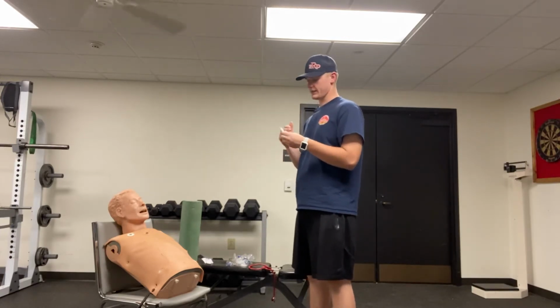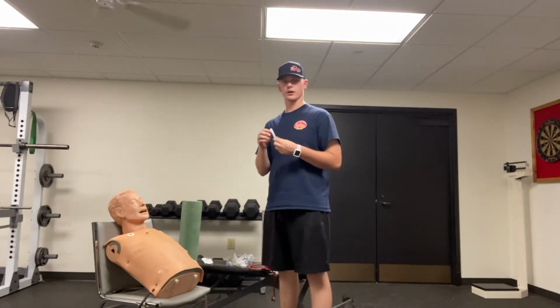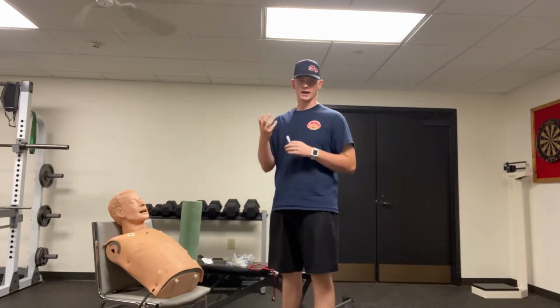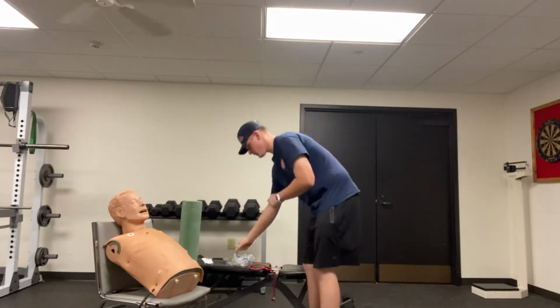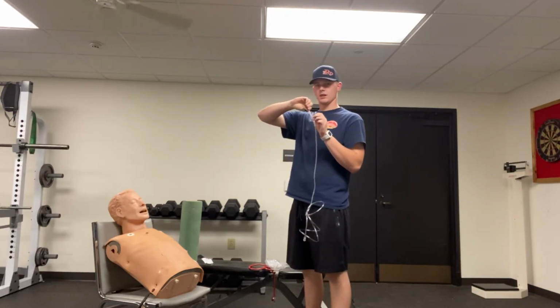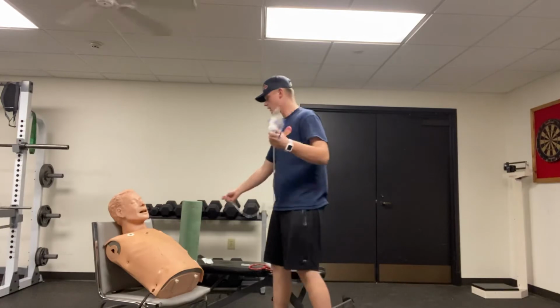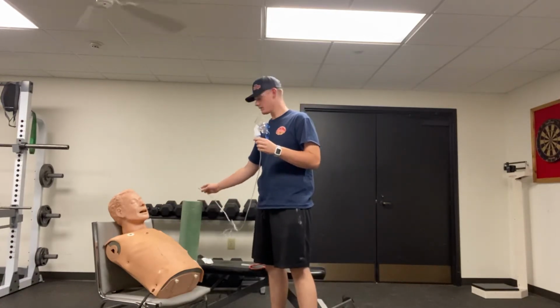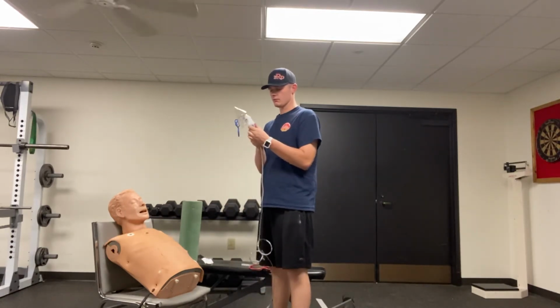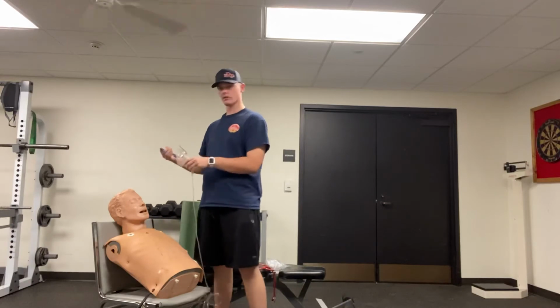After looking at the expiration date, so on and so forth, now I'm going to note the correct route. I will be giving this via inhalation by blow-by nebulizer mask. So now I'm going to insert the medication into the nebulizer vial. Now I'm going to connect the mask. I'm going to hook the blow-by mask up to oxygen. Okay, now I'm going to see that it is misting.